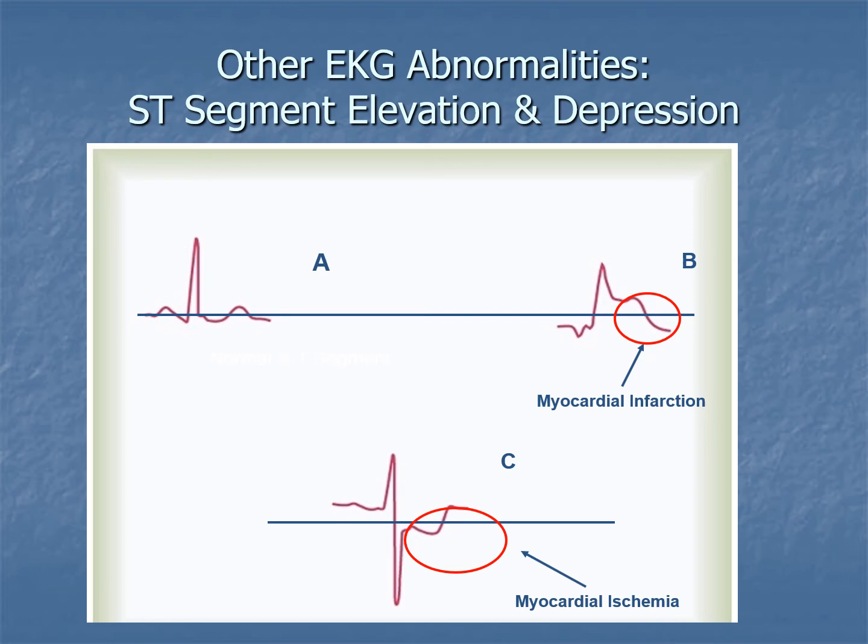There are non-ST elevation MIs, but again, this one is depicting up on the upper right-hand side what a STEMI would look like. The patient will undoubtedly complain that they have chest pain, it may be radiating to the jaw, they may be diaphoretic, etc. The exception there is you do get some patients that are having an MI, but you get women who, I'm saying this, some women just don't show the amount of symptoms.